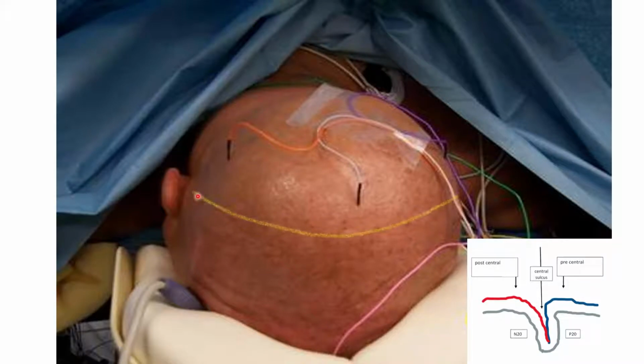This is going to simulate the central sulcus, and we know the central sulcus divides the motor and the sensory areas. If your electrodes are too far forward, you may have a bifurcated, or even if they're very far forward, an inverted response. Here's your central sulcus. Here's the precentral gyrus, or the frontal area, and here's the postcentral gyrus, or the parietal area.